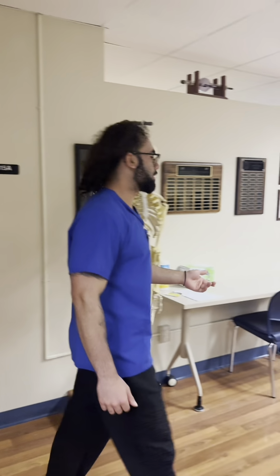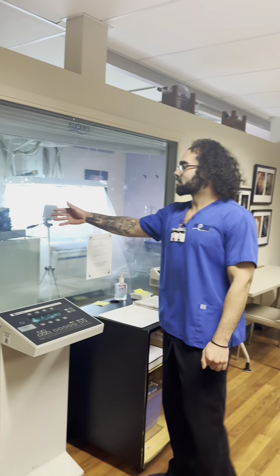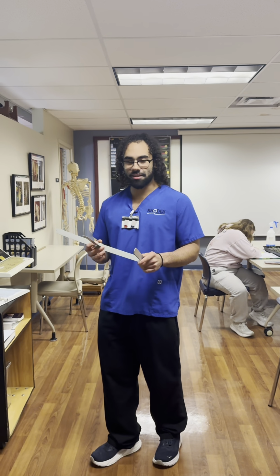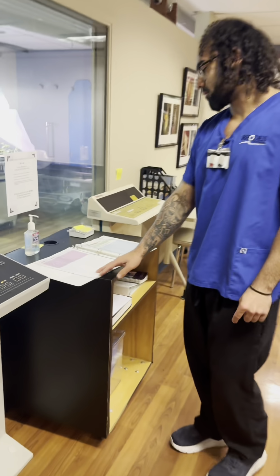Then we're gonna walk over to the control panel where we are protected by this lead line glass, so we as a technologist do not get exposed to any unnecessary radiation. All right, once you get your patient measurement with the calipers here, you're going to go over to your book, and you're going to set your exposure factors.